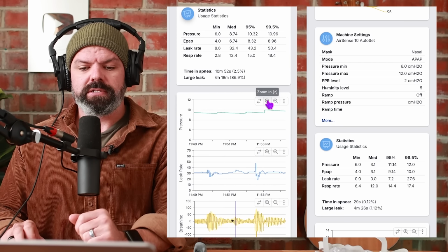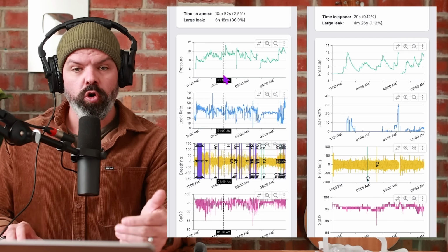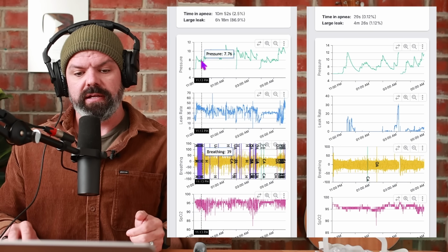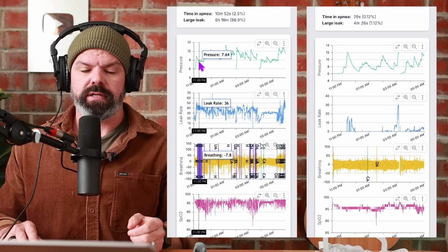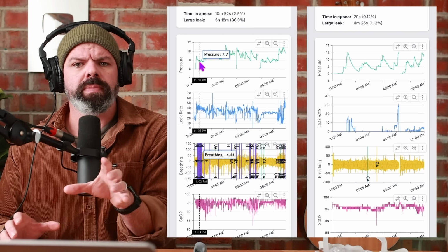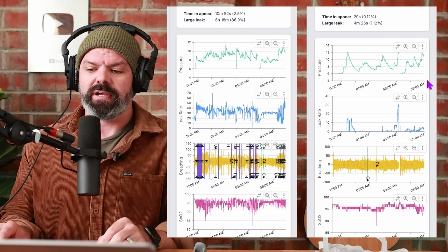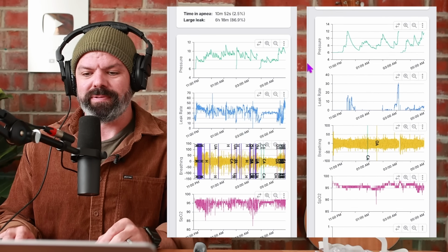Let's go down here. I want to show you this also. All right, have a look at the difference between the automatic pressure delivery, the pressure changing throughout the night over time. So this is when there's a lot of leak. Look at it jumping around. Have a look at that profile here, the green line. Right? It's jumping all over the place because it doesn't know what to do. It's coming down because of leak compensation, and it's bouncing up again because he's got a lot of respiratory events. It's all over the place. This is how it's supposed to look over here on the right. Look at the difference. Hey, I'll just bring that up a little bit.